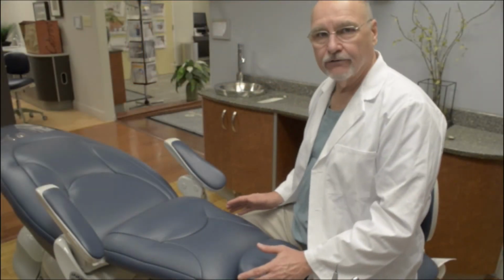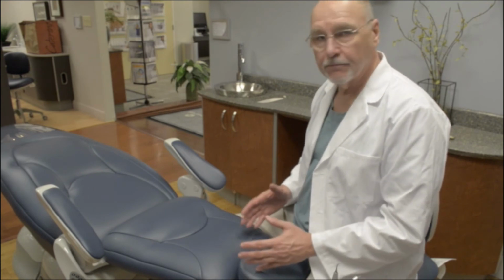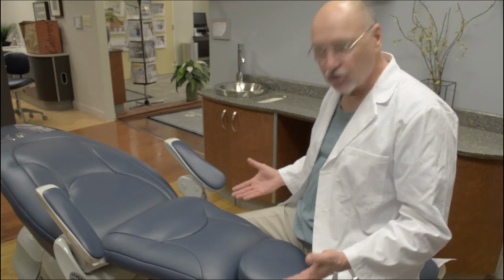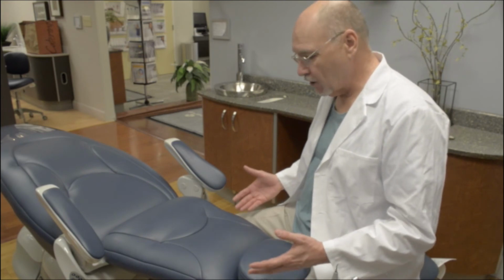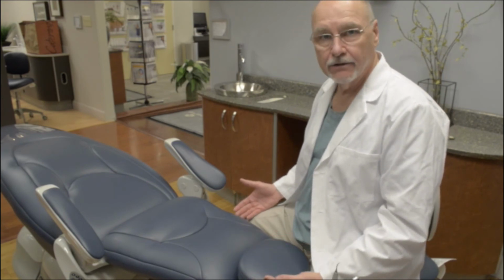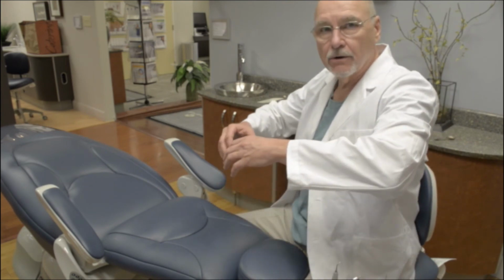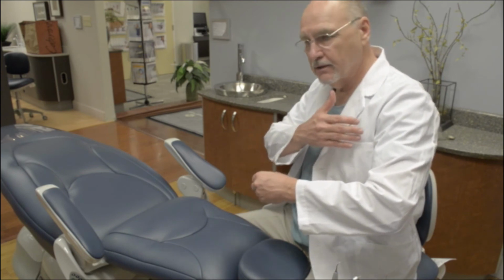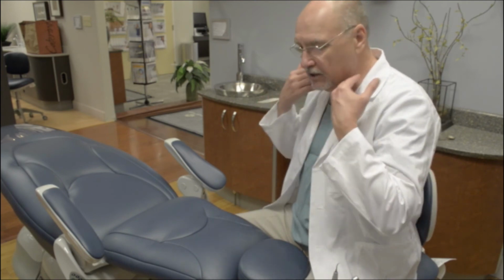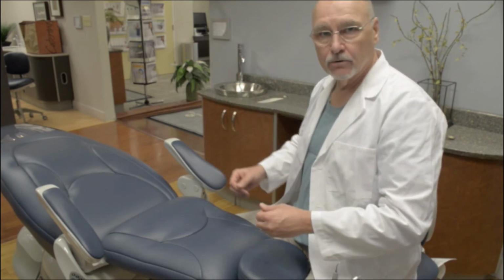It's essential to have a narrow chair because as the doctor approaches the chair to treat the patient, you notice we have to straddle the chair. There's no other way to do this, because if we put our knees underneath the chair, what happens is our elbows necessarily must rise. And this class 4 movement, once again, creates a lot of stress on the brachial plexus, the deltoid muscle, the trapezius, and the musculature of the neck. So we want to avoid that by having the elbows down at our side.